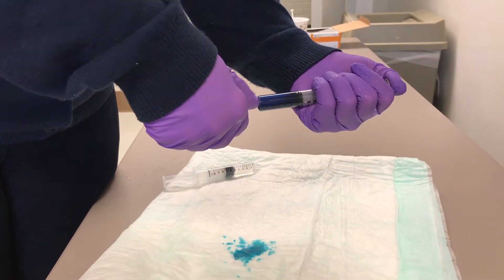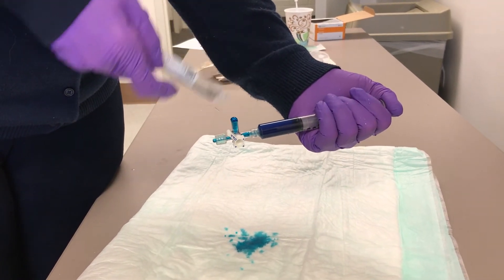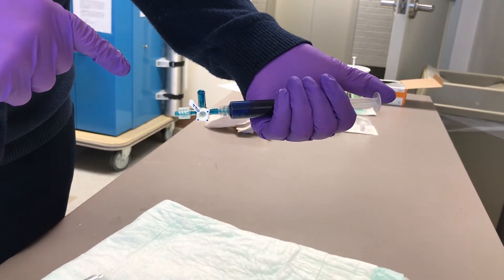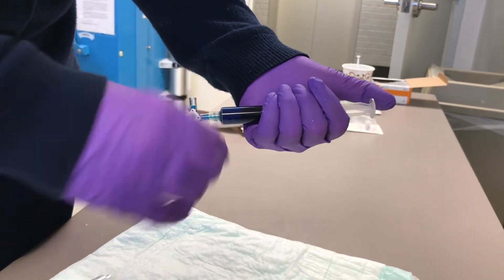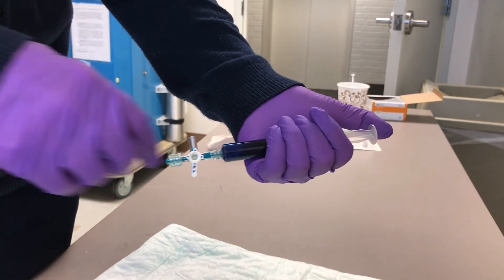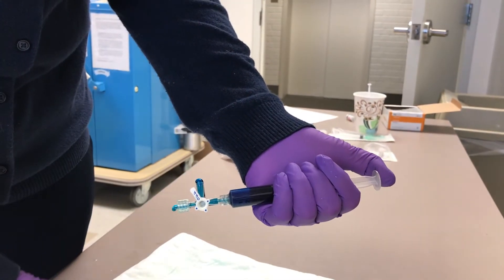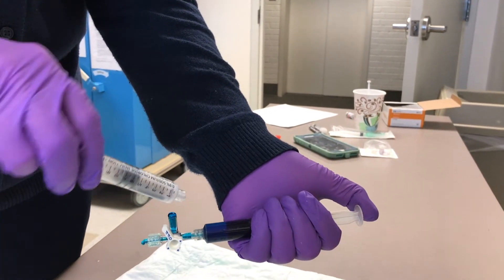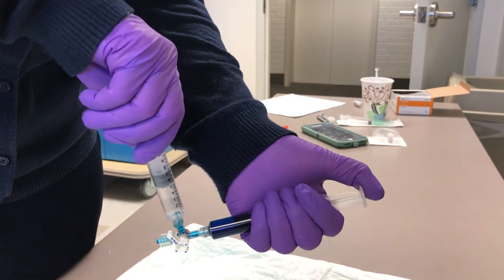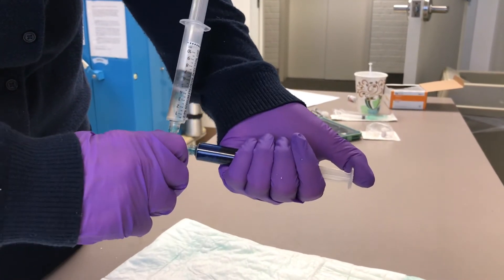Turn your stopcock off to the area that you're not using, prime the other end, and then come somewhere midway. Now if you needed to put another syringe on, you could put it right on top and secure it. To continue and be able to use the stopcock in all directions, you would turn it off to the area that you're not using. Once you've primed it all the way through, attach whatever medication you're going to be using — sometimes I'll do the drop method to make sure I'm not going to entrain any air.